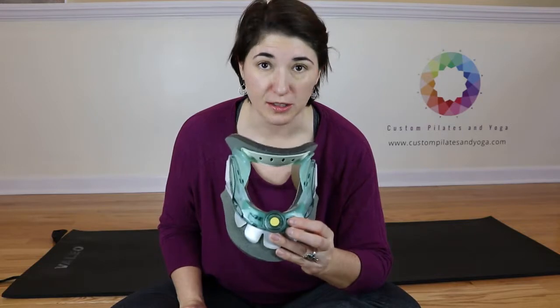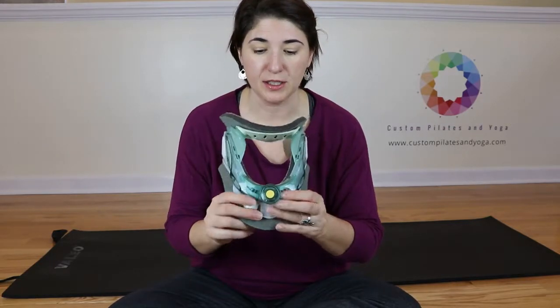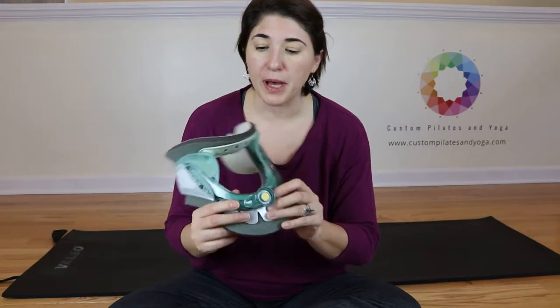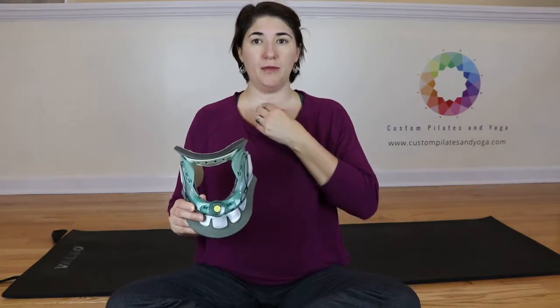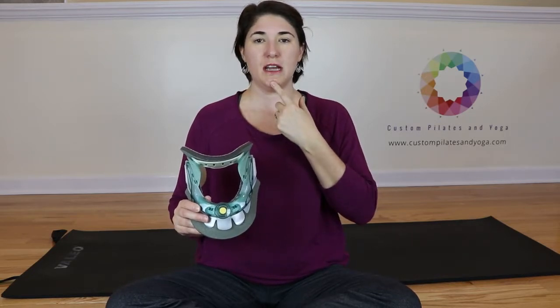Absolutely follow your doctor's orders about how you need to have your neck brace adjusted. My doctor told me that I wanted to be set up in neutral with my chin down.